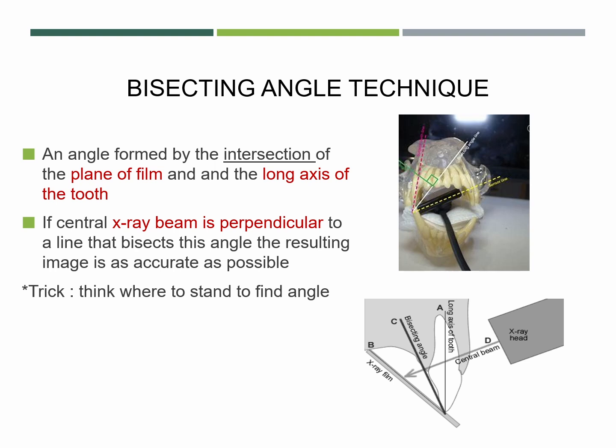Some teeth you're going to stand at the front, and some you're going to stand at the side of the head. Now, I'm going to give you a trick now. Start practicing your yoga moves, because to get the best angle, you want to squat down to see that angle. If you go from above and view it, you're going to get a skewed angle.